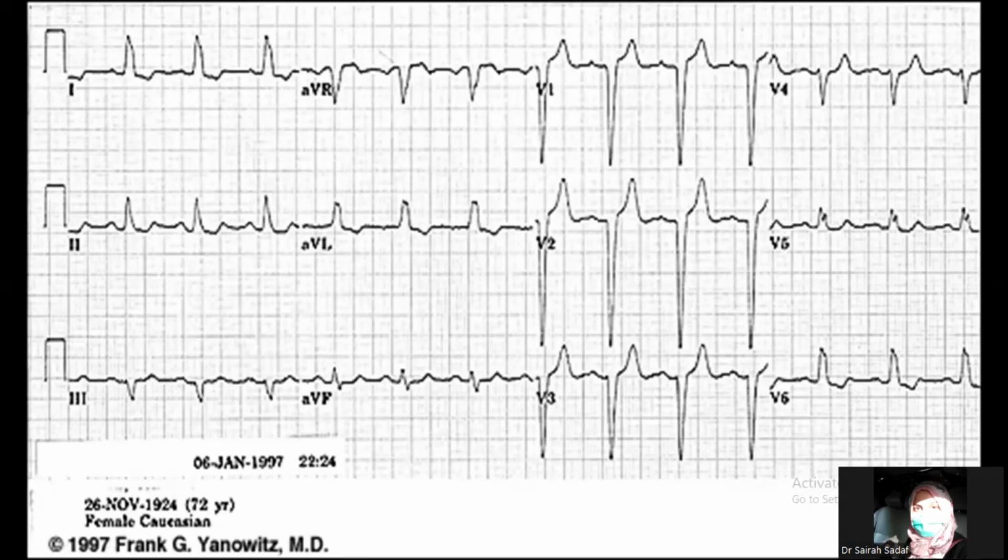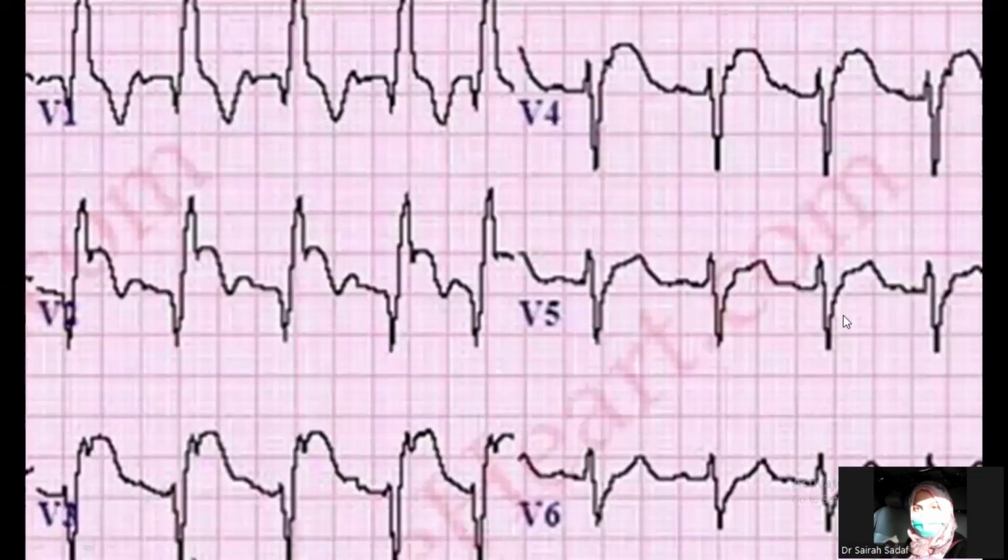This is LBBB because of the tall, broad, slurred wave. This is slurring, slurred wave. Okay? LBBB. What is this? This is RBBB. Is there ST elevation too?